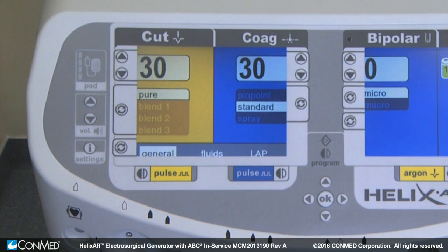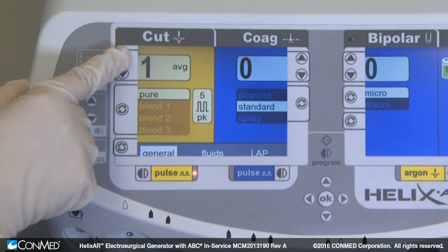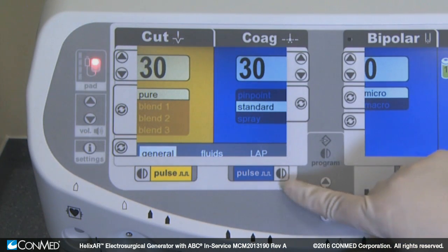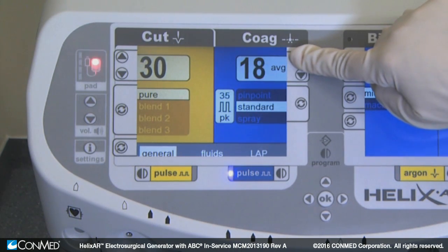The pulse cut selection key toggles between pulse cut on and pulse cut off. When pulse cut is on, note that the coag power settings default to zero. The pulse coag selection key toggles between pulse coag on and pulse coag off.